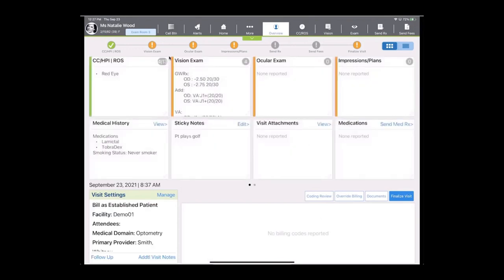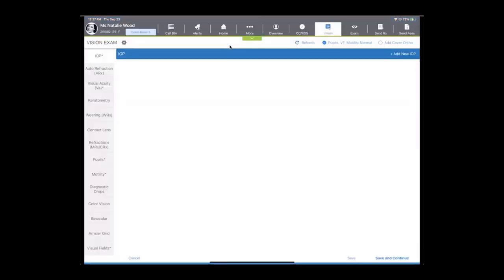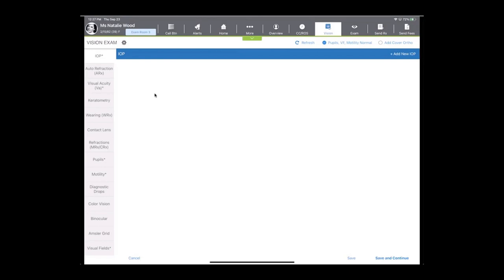Now we'll take a look at the vision exam. With the vision exam, I often think about it like the pretest. You see on the left-hand side of the screen several different sections for us to go into to notate pressure readings, our auto-refraction, keratometry data, wearing RXs, and then of course your ability to do a contact lens prescription or refraction, and then more information down at the bottom for additional testing, like color vision testing, binocular testing, Amsler grid, etc.